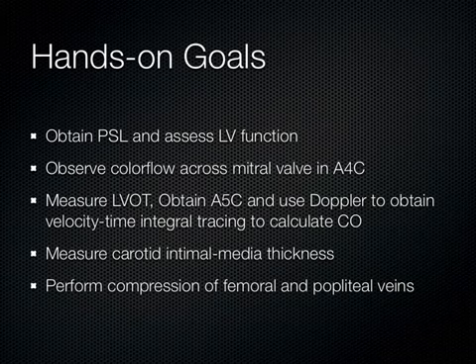I want you guys to measure the left ventricular outflow tract back in the parasternal long, get that LVOT diameter, plug that into the calculations package, switch over to apical 5, drop the Doppler on there, hit the trace, and watch how cardiac output pops up on the screen. I want you all to get that in your hands, march through that during our hands-on.